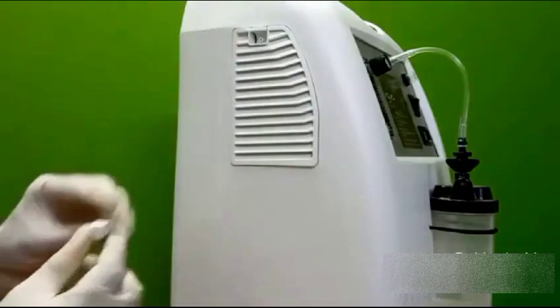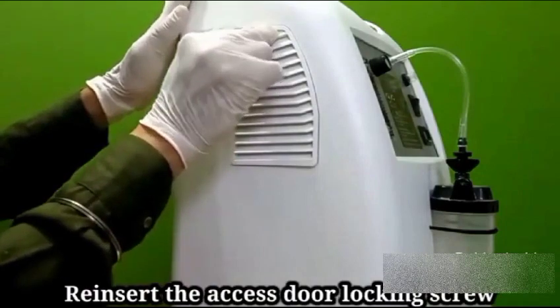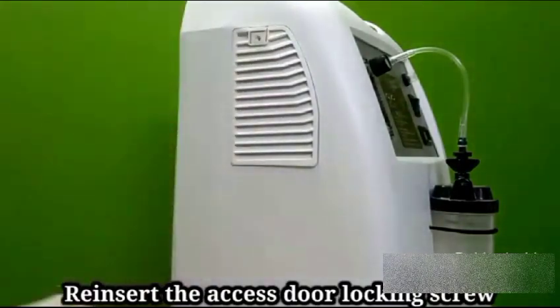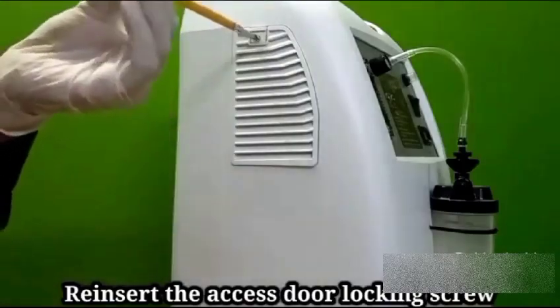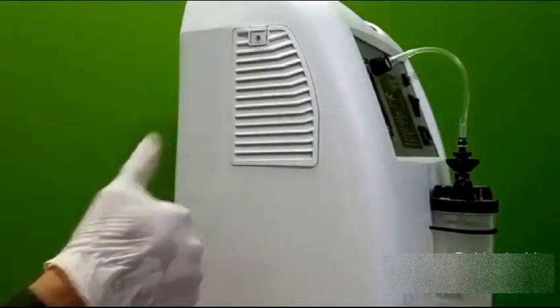You have to first apply the plastic lock. This will be the lock. After fitting it, there will be a screw here. You have to tighten that screw. Fit it in place.